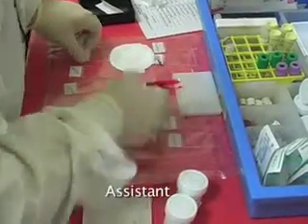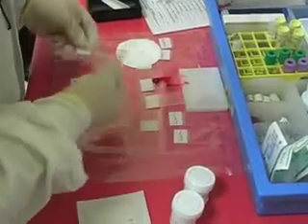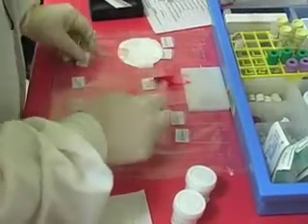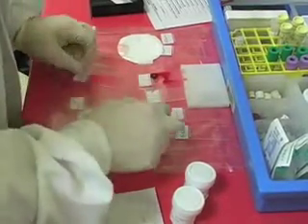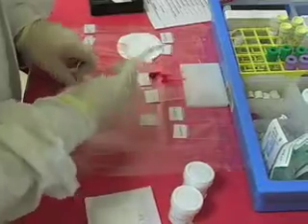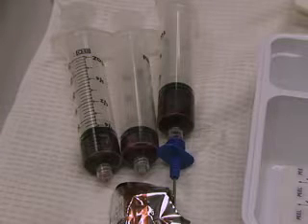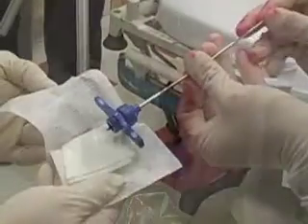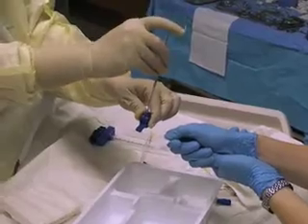A technician is often available to assist with preparation of the bone marrow aspirate and bone marrow biopsy. Aspirate smears may be prepared at the bedside from unheparinized bone marrow aspirate. This should be done quickly to avoid clotting of the specimen. Bone marrow aspirate may also be sent to the lab for further analysis in heparinized syringes. The core biopsy specimen should be collected onto a sterile gauze or slide and inspected for adequacy of marrow.